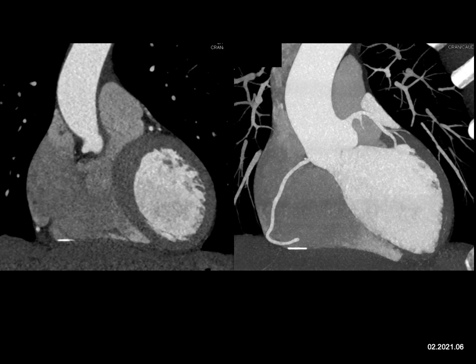And when you look, this is a broken needle. This patient was an IV drug abuser. This was a needle from an injection that broke off and tracked all the way into the patient's heart. Now, you can argue, should you go in and get that? That's probably going to be very hard. And at this point, maybe there's some granulation tissue around it. They decided to simply watch this patient, but it's a beautiful example of a broken needle in the right ventricle.